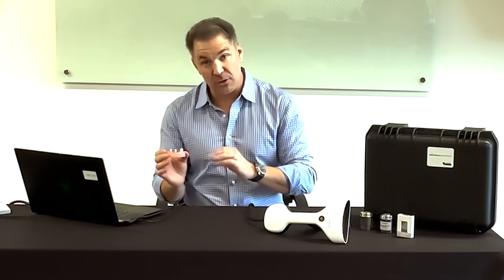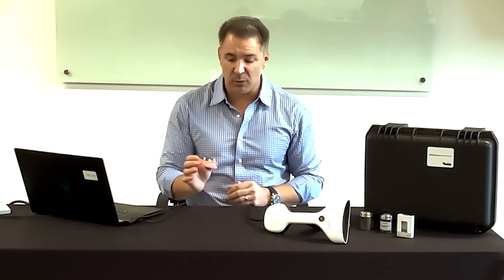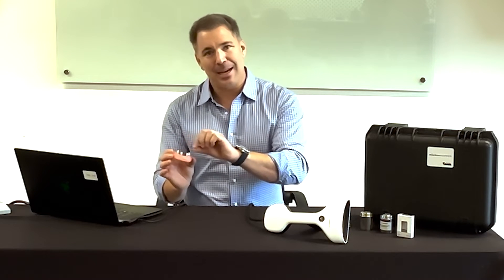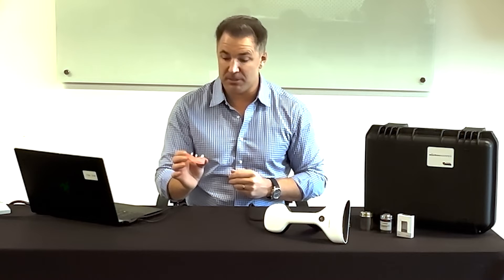We have two different types with different dimensions. We find they work very well compared to any competitors in the photogrammetry space, specifically when you get into pterygoid cases or cases with quite a few implants. You can scan a case, take one off and capture a scan body behind it in the event that it's hidden and the camera is unable to pick it up.